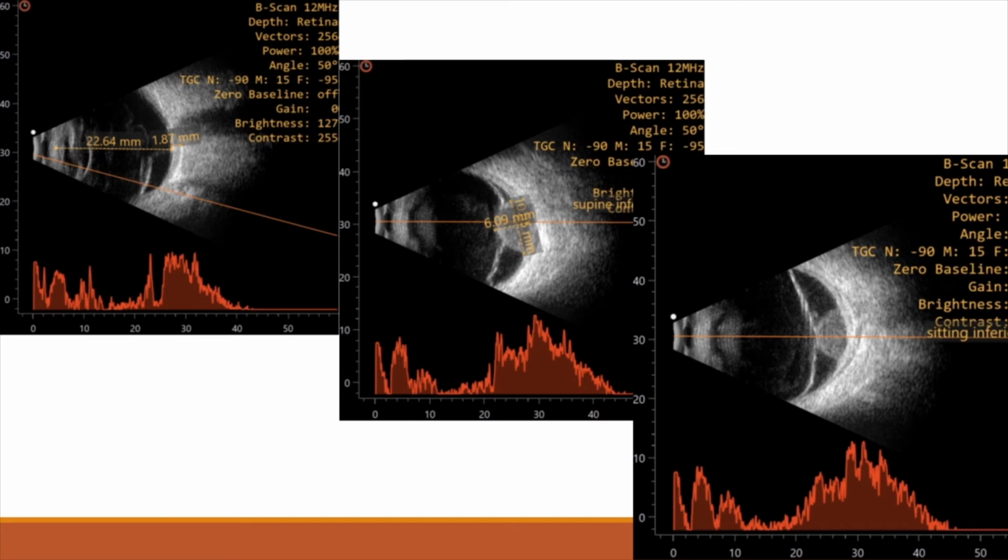But that depends on the speed of the blood within it. When you have a vascular lesion, what is the basis of generation of an ultrasound image? When do you get an echo? When the sound wave strikes tissue. Yeah, you need to have interfaces, and a vascular lesion is full of interfaces. So when you have a vascular lesion, because you have interfaces, you get echoes.